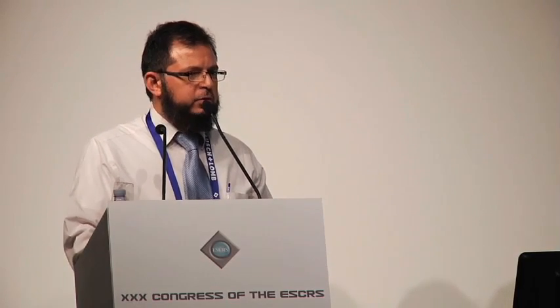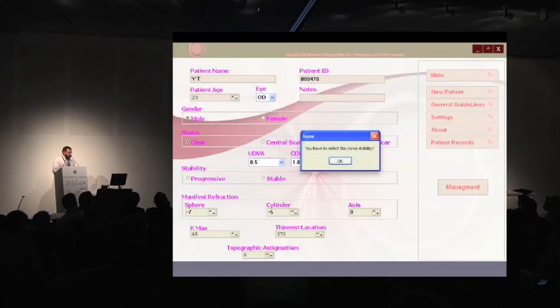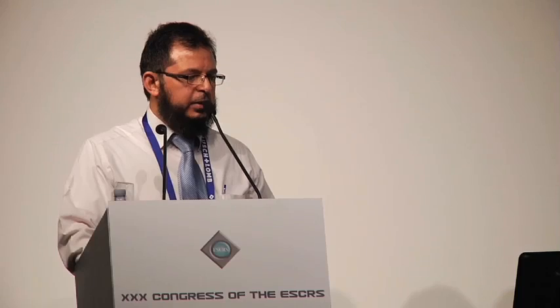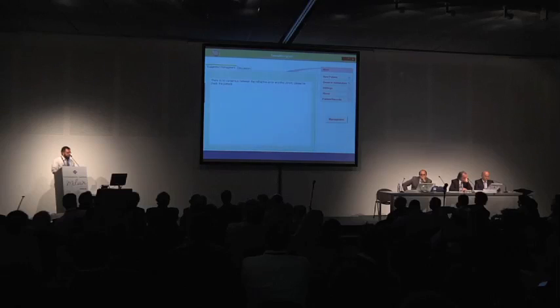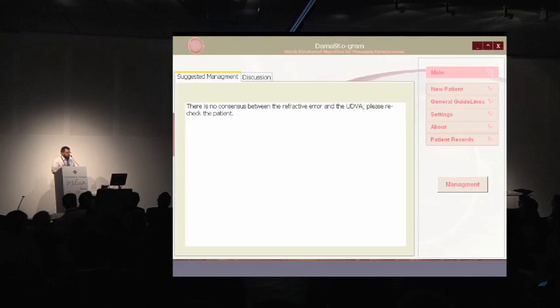Some features of the software: when the doctor, by mistake, skips inputting some data — like not specifying whether the case is progressive or stable — a warning will appear. Also, when the data are not logical, such as a very high refractive error combined with an uncorrected visual acuity of 0.5, a message will appear indicating there is no consistency between the refractive error and the uncorrected visual acuity, advising the doctor or optometrist to recheck the patient.